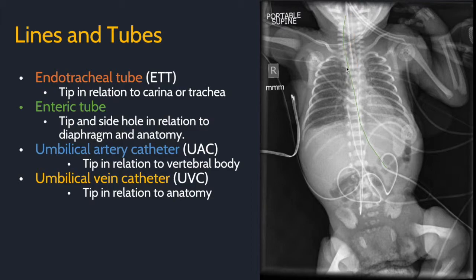The enteric tube is in green. Describe where the tip and the proximal side hole are in relation to the diaphragm and anatomy. Here, the tip is below the diaphragm, likely in the stomach.